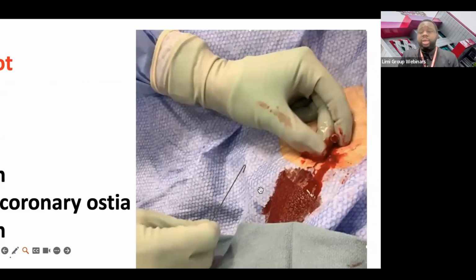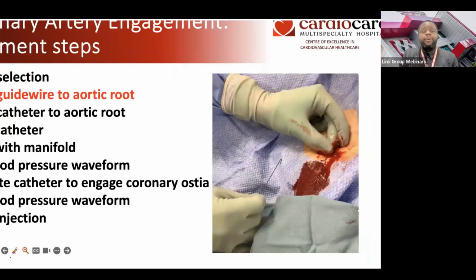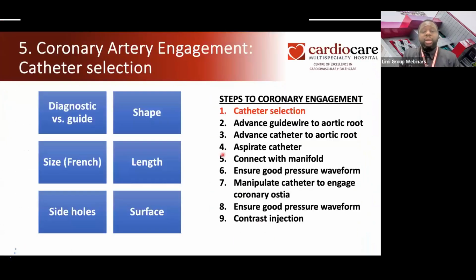The guide wire is J-shaped. You can see it's J-shaped, so that when it enters into the vessel, it does not pass through the vessel, does not tear it, even though it is blunt, but it is still J-shaped, just to make sure that it's going in. There's little or no chance for problem. So pass the guide wire like that. Okay, good. So we pass the guide wire.